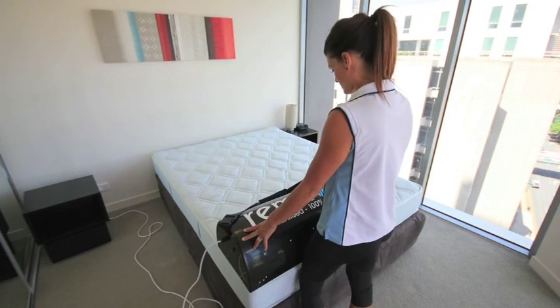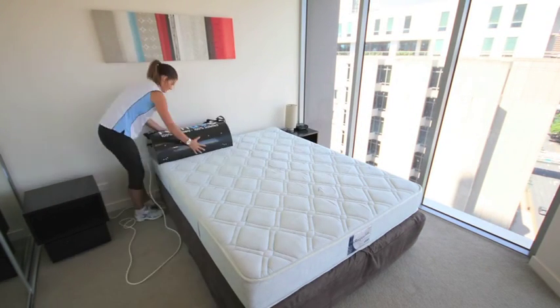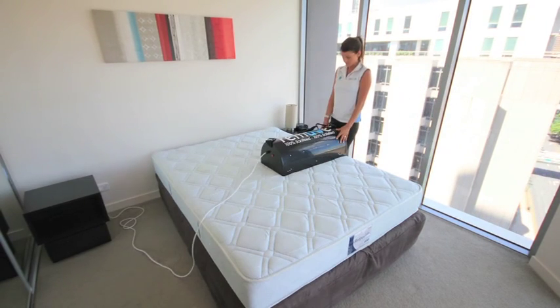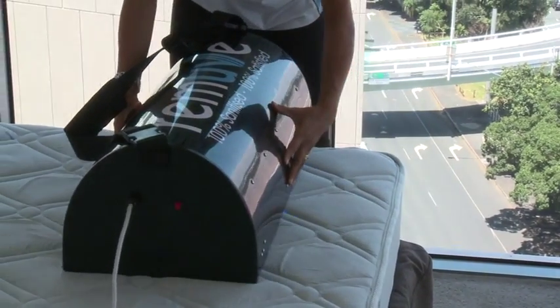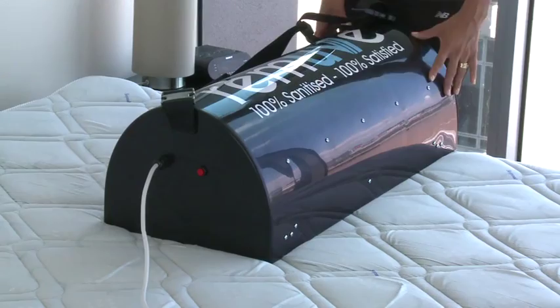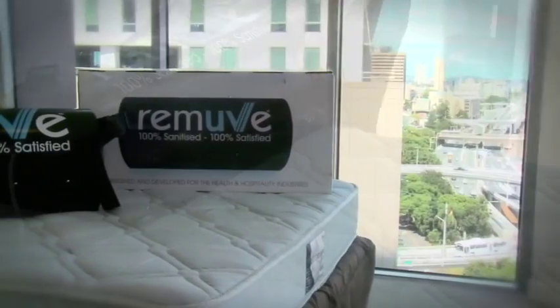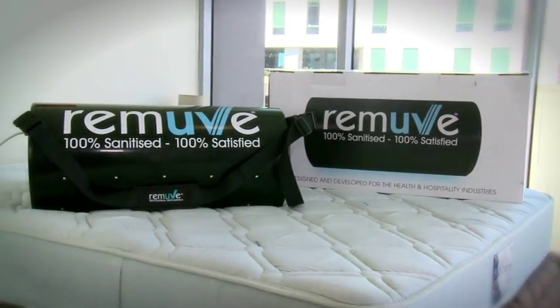A queen size mattress can be sanitised in under two minutes. REMOVE is now the world's first specialised mattress sanitising equipment, designed by UV experts to kill all human pathogens and other nasties that are present on your mattress, leaving the bed 100% sanitised and the occupant 100% satisfied.